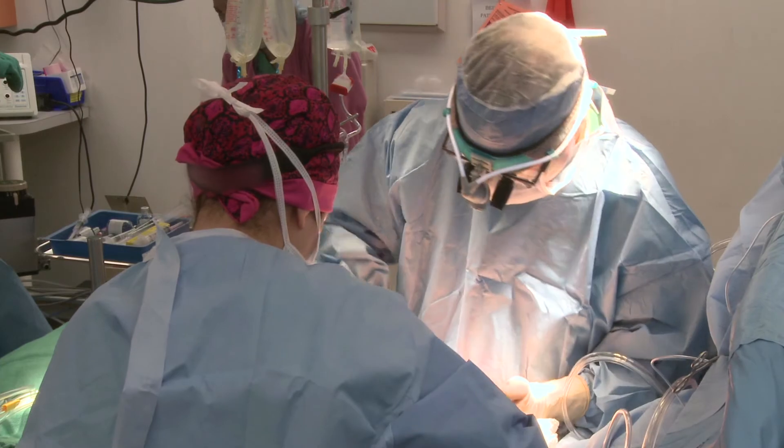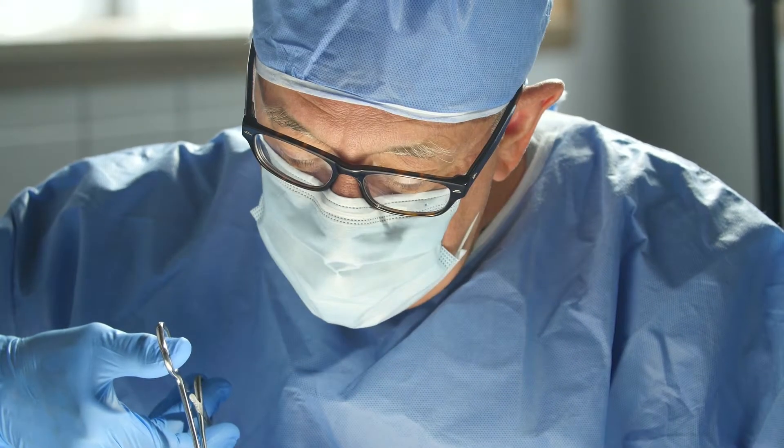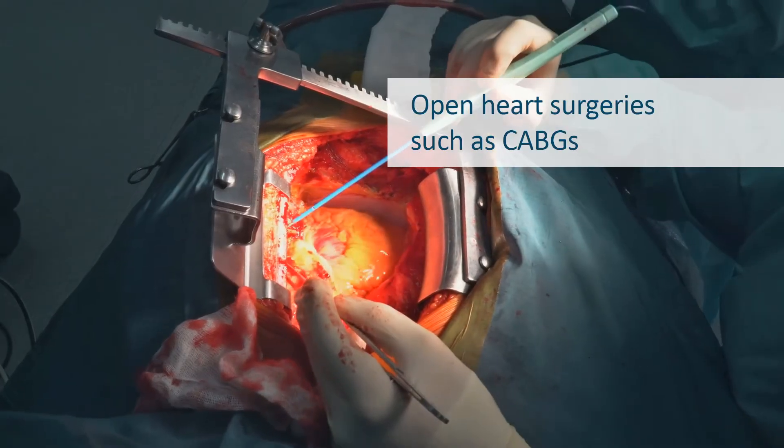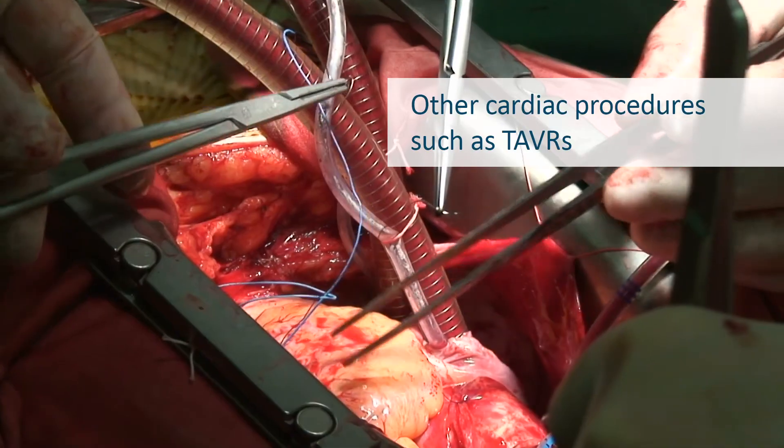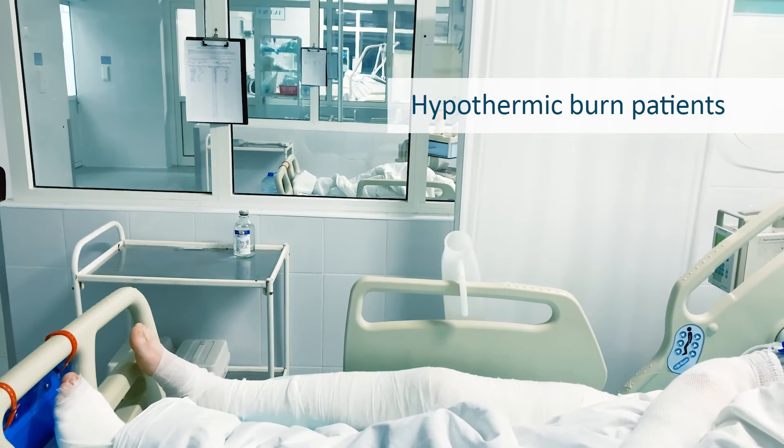Alon has been shown to achieve normothermia more consistently than routine forced air warming methods in transplant surgeries, open-heart surgeries such as CABGs, other cardiac procedures such as TAVRs, and hypothermic burn patients.